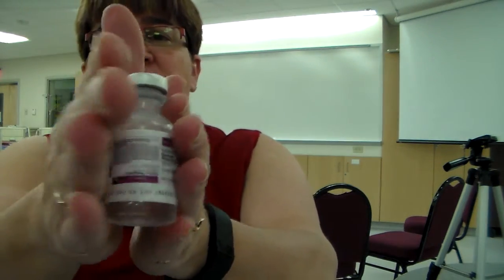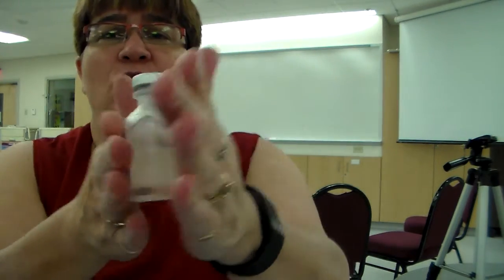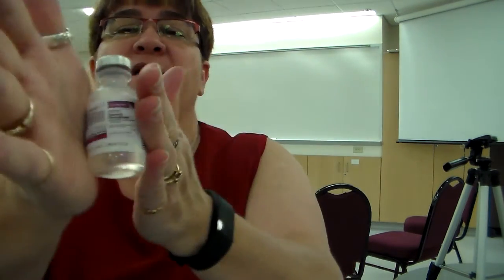All right, so you're going to mix the medication solution as needed by rotating the vial between the palms of the hands. So we're not going to take our vial and violently shake it to make sure that the medicine is all shaken up, because what are you doing? You're putting bubbles in your solution, so you don't want to do that. You're going to just roll it between your fingers. Just roll it back, and, whoops, you don't drop it. Roll it back and forth.